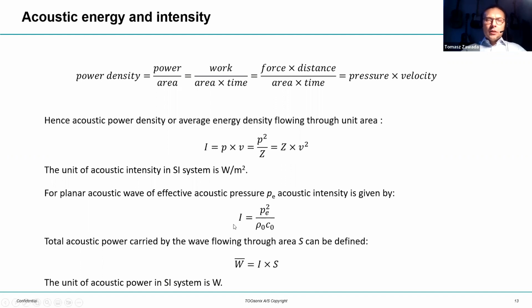Usually people show this formula, saying that we have pressure, we square the pressure, divide by the acoustic impedance, and we have intensity. What we actually estimate is the magnitude of acoustic intensity. But nevertheless, those things are used in practice, and that's the way to understand the field.